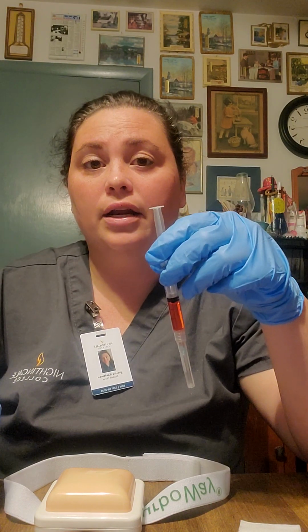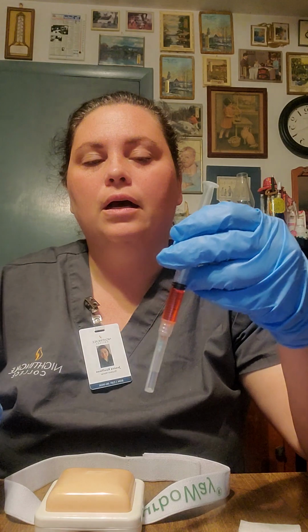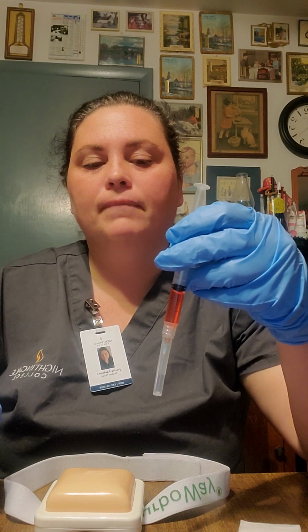And when I do this injection, I'm going to go slow, and I am going to do it at a 90-degree angle. I'm going to remove the cap. Alright, and with my placement, I'd have my finger and my thumb down here like so.